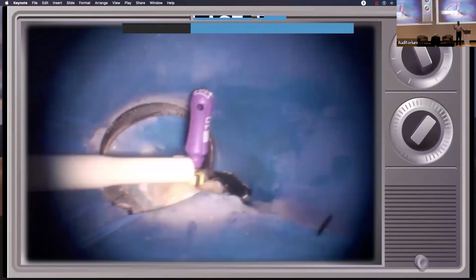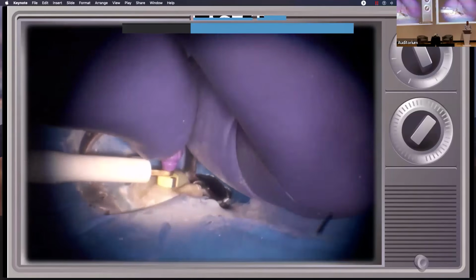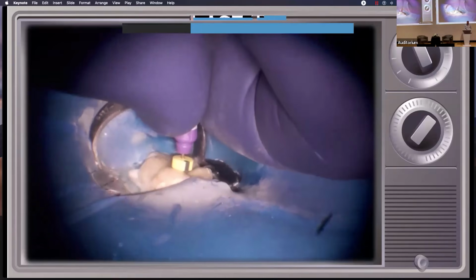Okay, length. My go-to is a 10 hand, just my routine. If you'd want to use an 8, that's fine. I find the 10 gives you the most stable readings. And if a straight 10 hand goes, case is over. The first big hurdle is finding the canals. The second big hurdle for me is getting the straight 10 hand file down. Once the straight 10 hand file's down, it's over. Love that sound. So MB looks like about 23. 23 from the MB. 22 and a half.